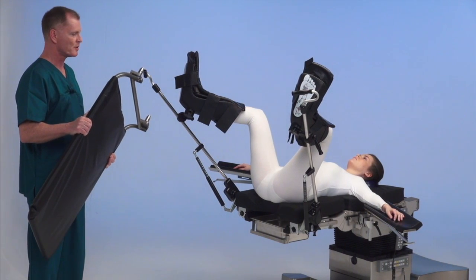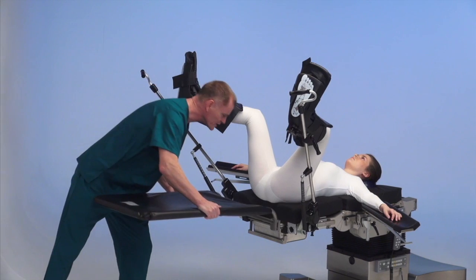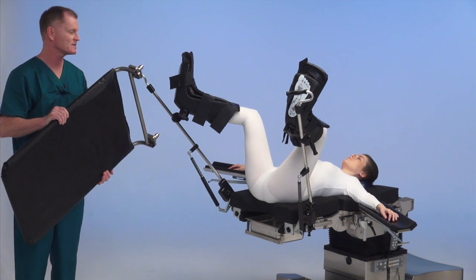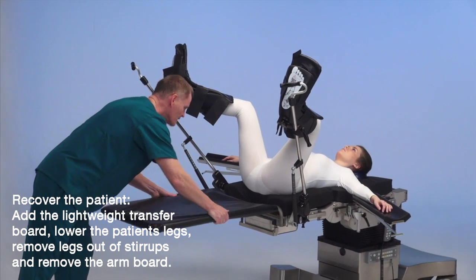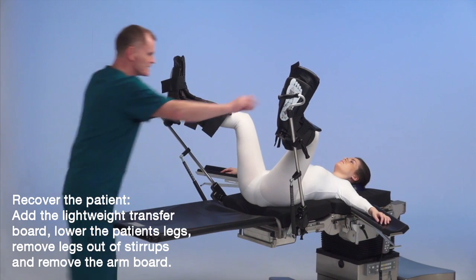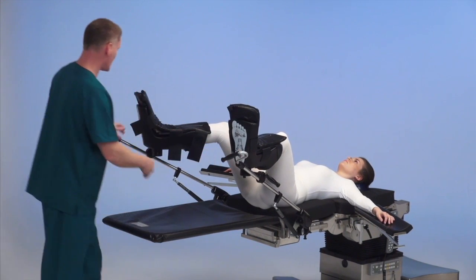We're ready to recover the patient following surgery. The nice part of this transfer system is you don't have to reach into the surgical area following the case to get the transfer board back on the table — you can do it from the end and it locks into position. Then lower the patient's legs down.